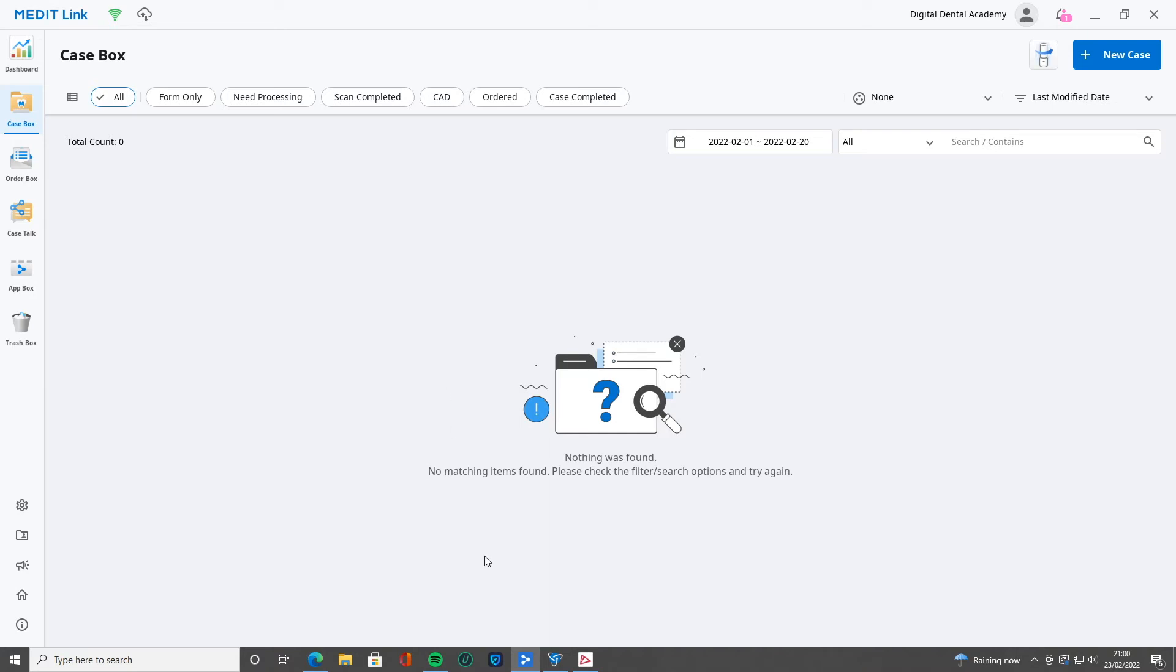So you've got your cases here, and you're wondering how to send it. How do you connect up with your lab? There are no options here for that. For that, we have to go to the website.